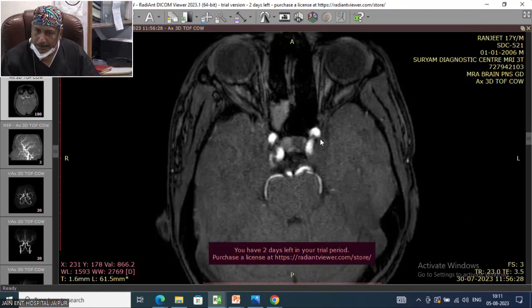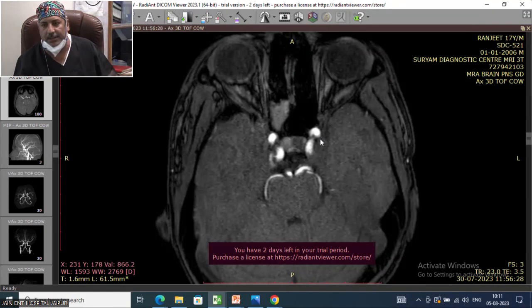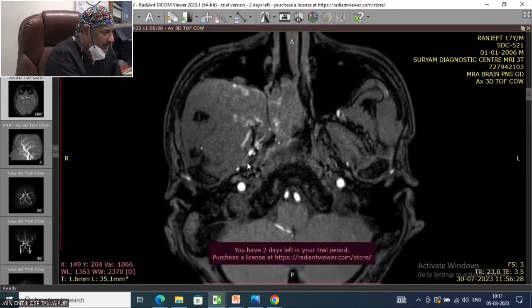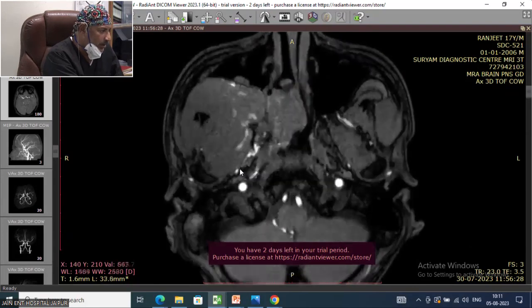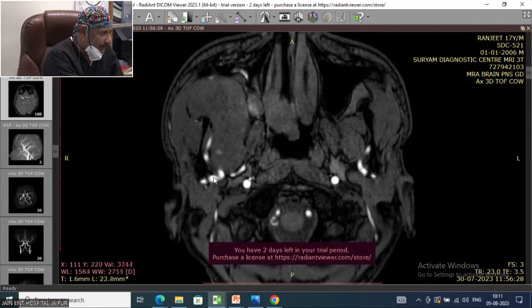If some vessel is the principal one and supplying from behind, which you cannot access endoscopically without mobilizing the tumor, without going into the tumor, obviously you have to embolize, otherwise it will not allow you to work. So this angiogram will tell you what vessels are supplying, how they are entering into the tumor, and whether this needs embolization or not.